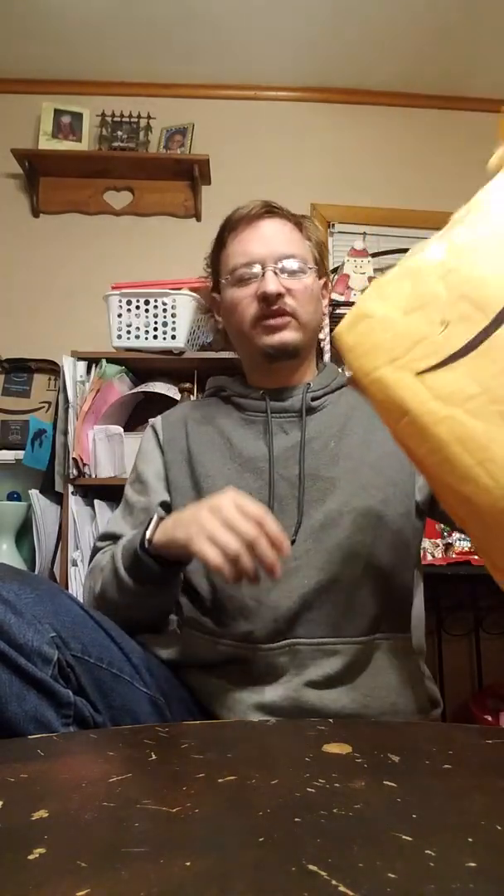Hello everybody, and welcome to another unboxing video. I got a big bag here full of stuff, so we'll pull one out at a time. And we got an infrared thermometer.